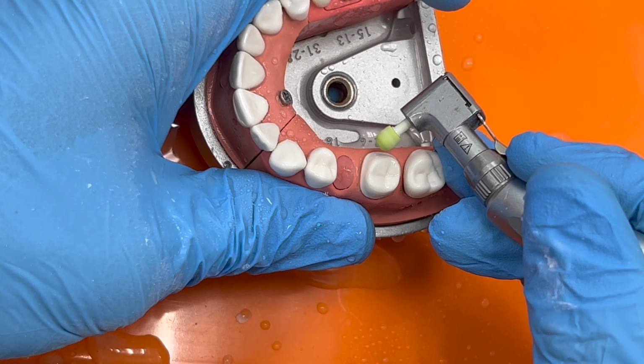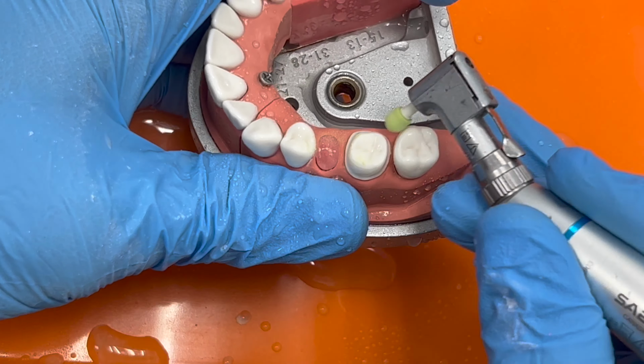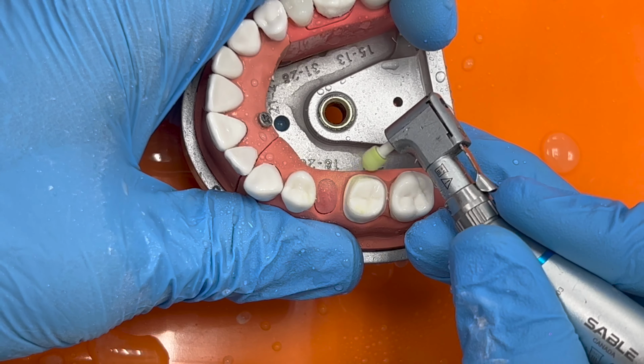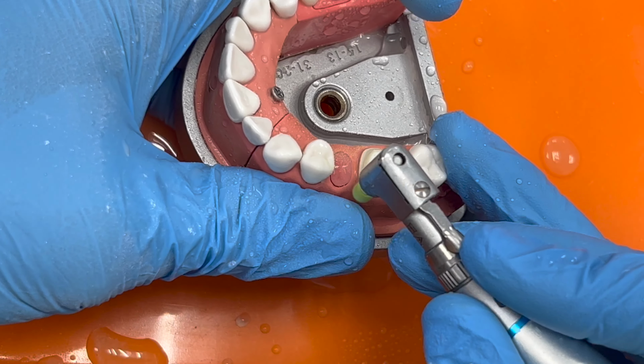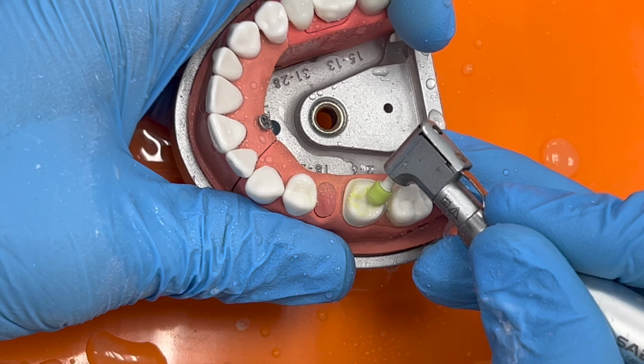Now that the preparation is complete, I use a cone-shaped polishing burr and a polishing disc to round any sharp angles and smoothen the prep. I go over the margin a couple of times with the cone-shaped polishing burr to make sure there is no unsupported enamel.